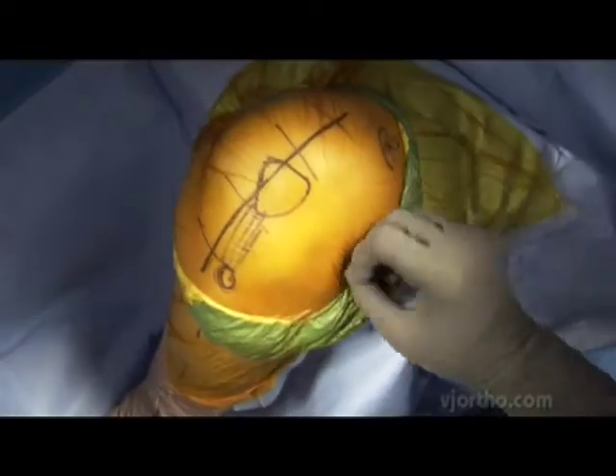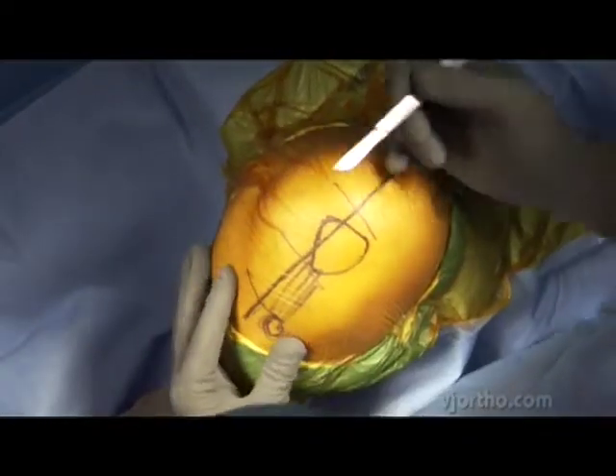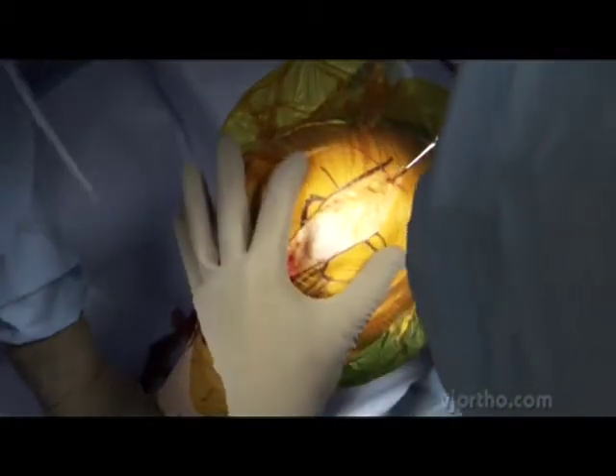She has various malalignment. I've marked the tibial tubercle — you can see the patella. We're going to make an incision from just medial to the tibial tubercle, and try to extend up onto the mid portion of the quad tendon.